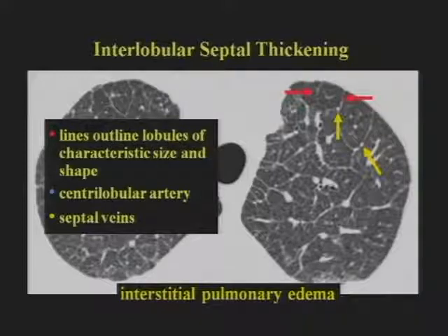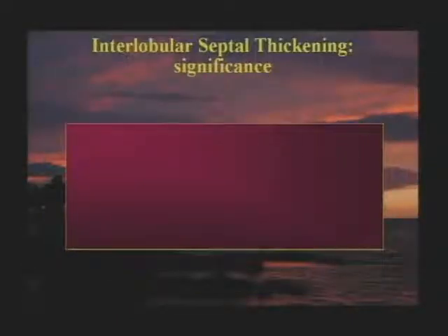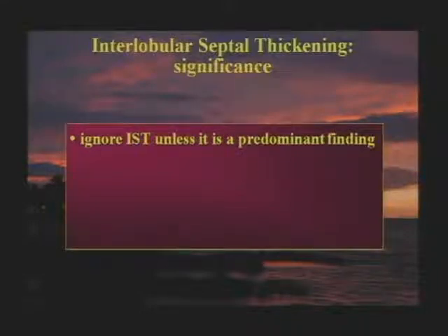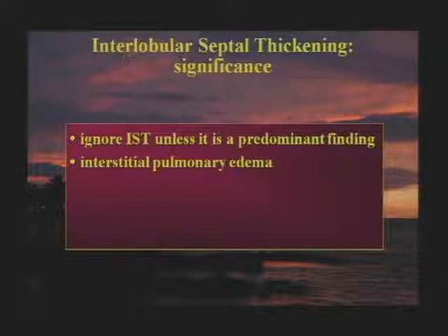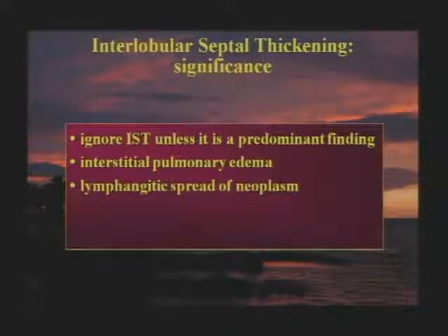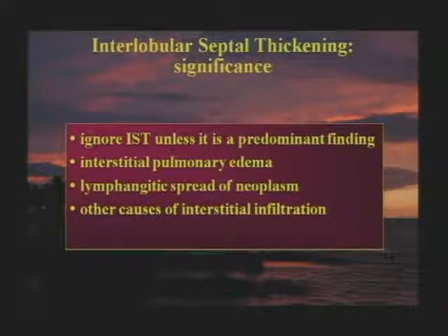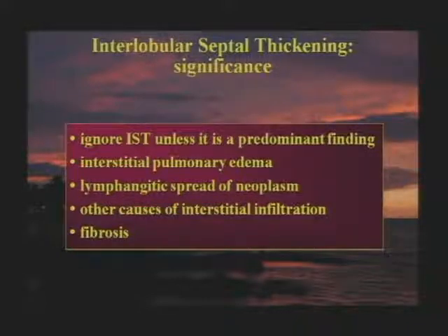Interlobular septal thickening in this case is due to interstitial pulmonary edema, certainly a common cause. What do you do if you see interlobular septal thickening on high-res CT? First, you ignore it unless it is the predominant abnormality, because a little septal thickening is very common in almost any diffuse lung disease, and unless it predominates, it has no value in differential diagnosis. Interstitial pulmonary edema is a common cause. Lymphangitic spread of neoplasm is also common. Some other infiltrative diseases cause septal thickening, but they're relatively rare — for example, amyloidosis. Patients with diffuse lung fibrosis can show interlobular septal thickening, but it is characteristically irregular in contour.